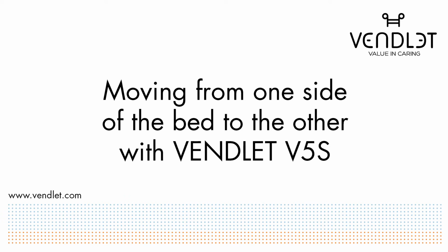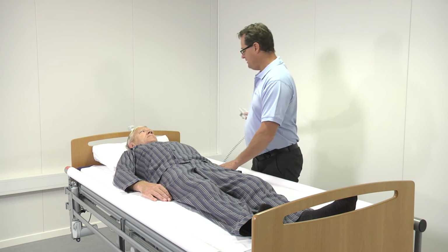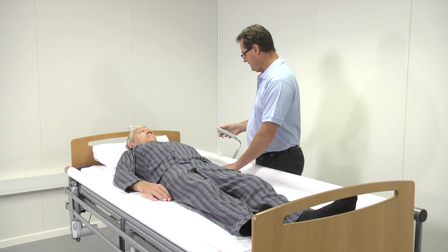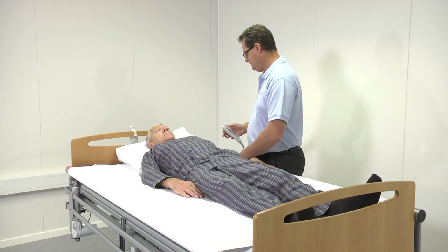VENDLET V5S is also used to move the client from one side to the other in the bed. As a safety measure, the bar may be raised a small amount at the side to which the client is pulled. In this case, the blue side. Wind the sheet onto the blue bar. The client is now moved to the side of the bed.